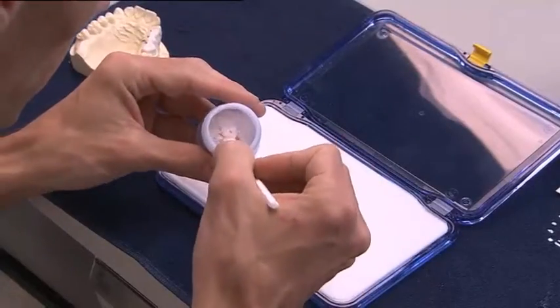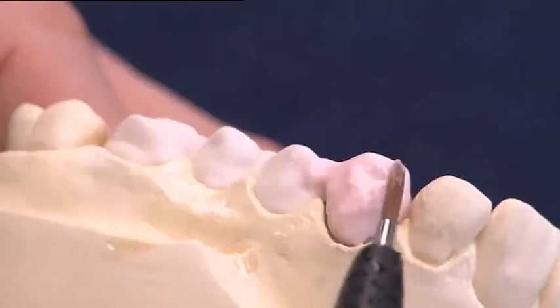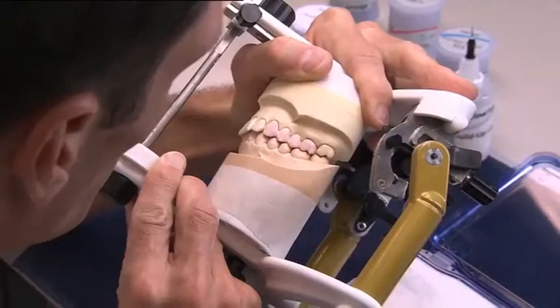The dentin material is mixed with the buildup liquid. It can be ideally layered and features excellent stability. The entire tooth shape is contoured starting from the incisal. The available space is checked in the Stratos.